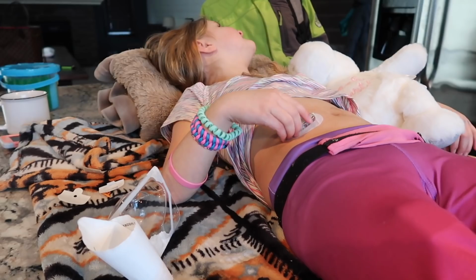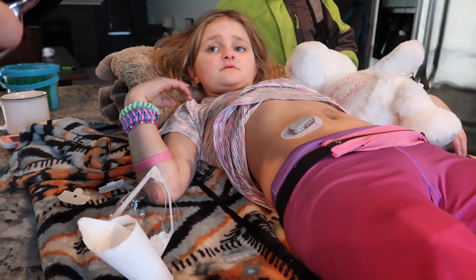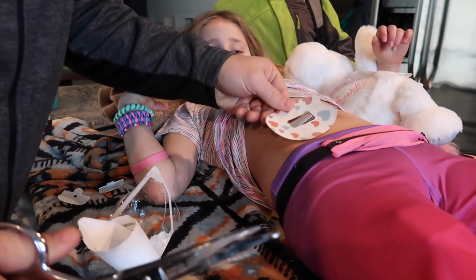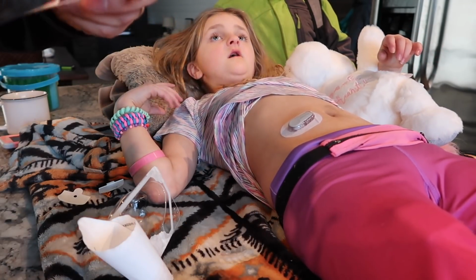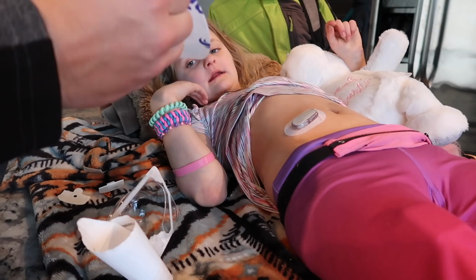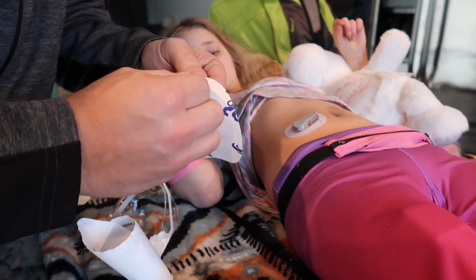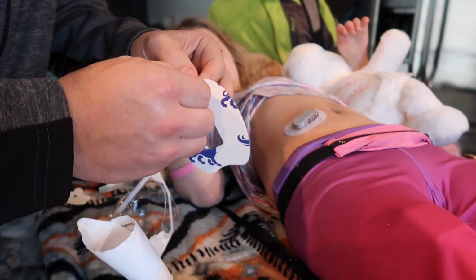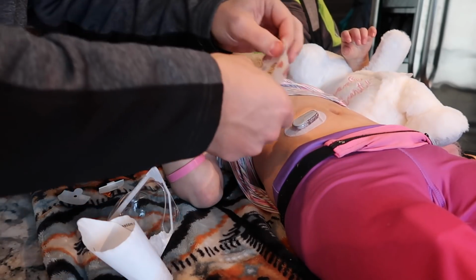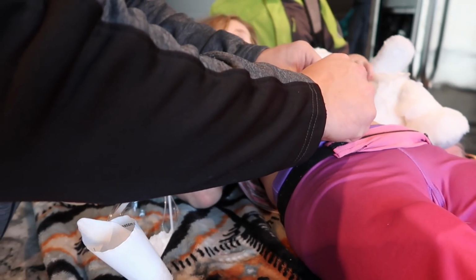Okay, let's do one of these really quick. One more minute, Daddy. It's the heart one again? Yeah, I just grabbed the first one. Got to custom cut it for Nevaeh's belly button. Another thing I liked about the Expression Med ones better than these grips: they don't fall into pieces. The backing on these sticky things was split in half, so it was a lot easier to take off. We gotta go back. I know.